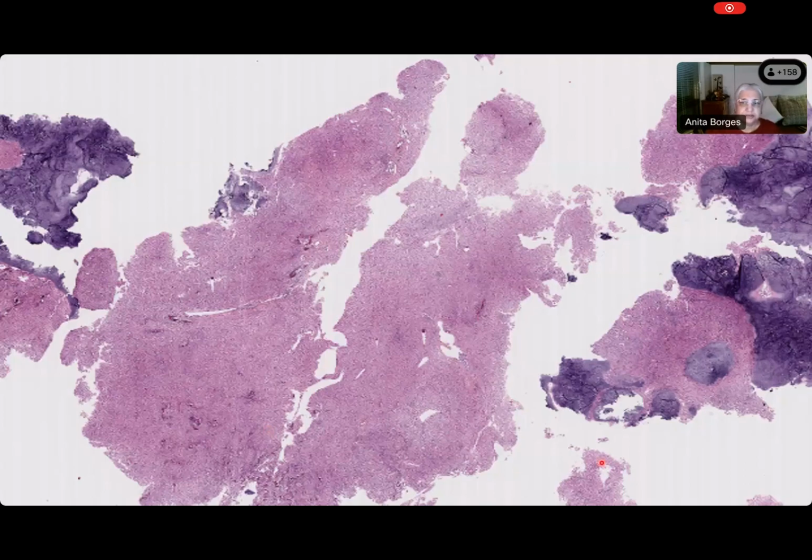What are these blue things and big things, Prayas? What do you think is that blue stuff that you are seeing? Cartilage. So there is cartilage. Okay, so you see fragments, very irregular fragments of cartilage, and then fragments of a very cellular tumor. Yes, it must be a tumor because nothing else can do this.